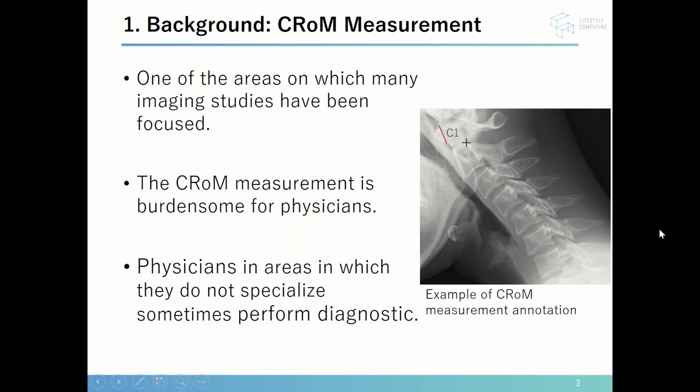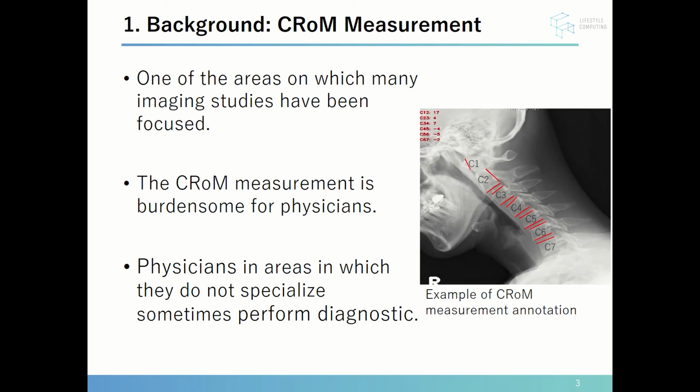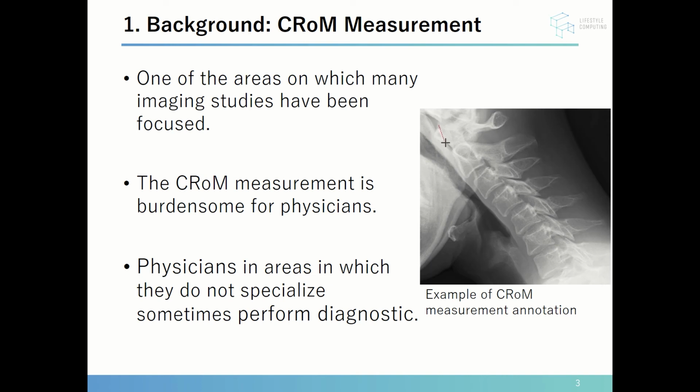I explain why I study this work. There are 3 reasons. The first reason: the cervical spine is one of the areas on which many imaging studies have been focused. The second reason: CROM measurement using X-ray images is burdensome for physicians. The third reason: physicians may be asked to perform diagnostic imaging in areas in which they do not specialize because of a lack of physicians.